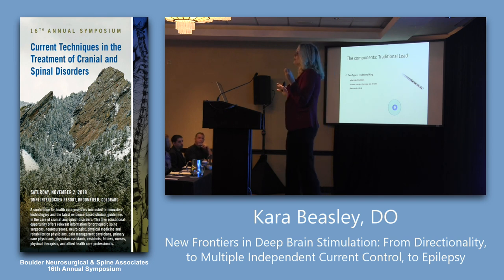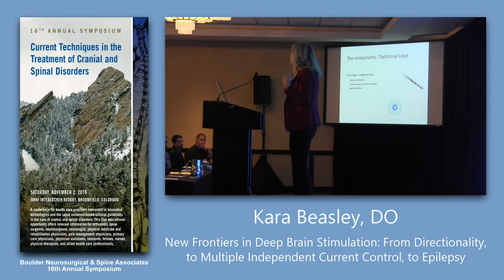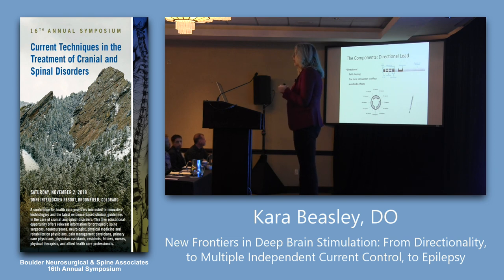When I say placement, I'm talking about half a millimeter to a millimeter and a half. There's one paper that says 3 millimeters, I think that's crazy. But half a millimeter to a millimeter and a half deep in the brain makes a big difference, particularly when you have this circular or ring type configuration, which I'll now refer to as ring mode or omnidirectional. A directional lead, and there are two companies now on the market that have them, means that you can actually now shape the field.